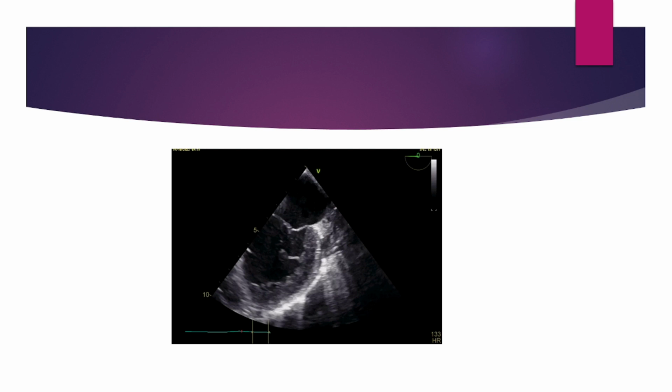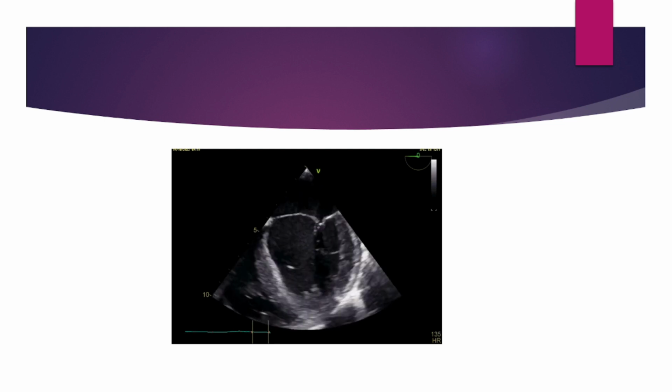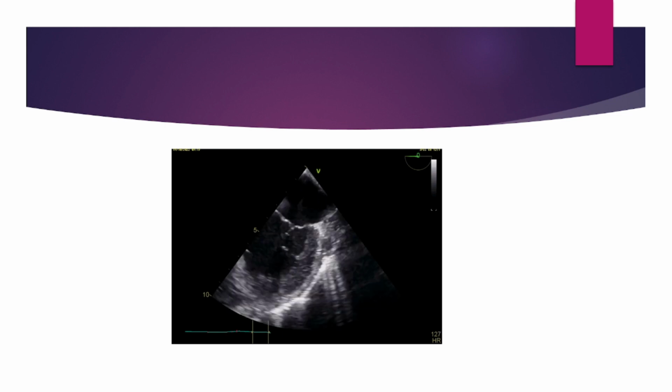So basically, this is a lady who came with 4 valve destruction after endocarditis, and we planned with the surgery team involved, Dr. Abdullah Ashmak, a very senior cardiac surgeon, how to plan her management. Actually, the thought was to go and replace almost 4 valves, then we reconsidered repairing 3 valves and replacement of 1 valve, which was done successfully. This is her intraoperative TEE showing.